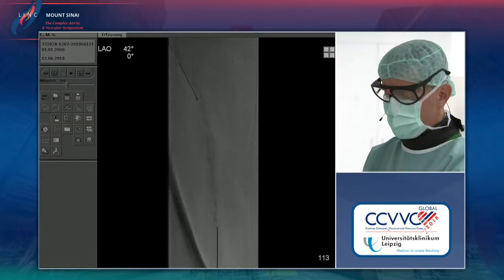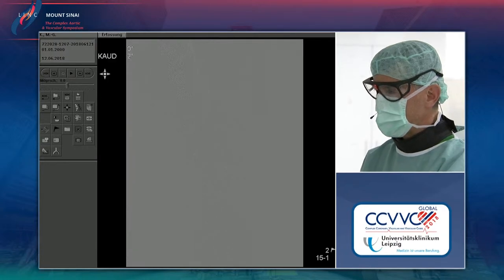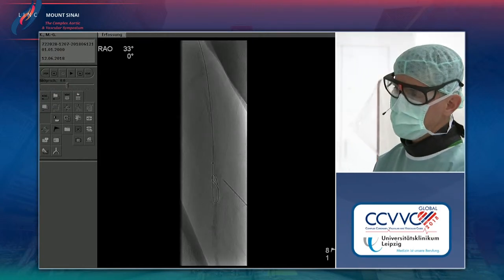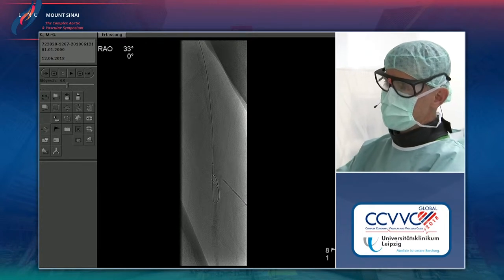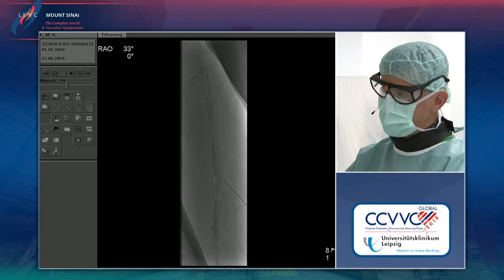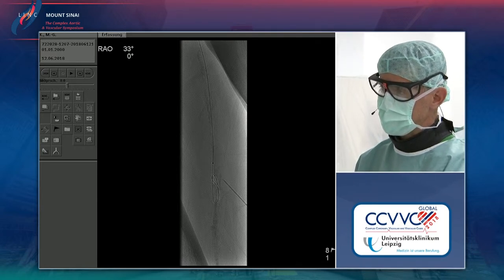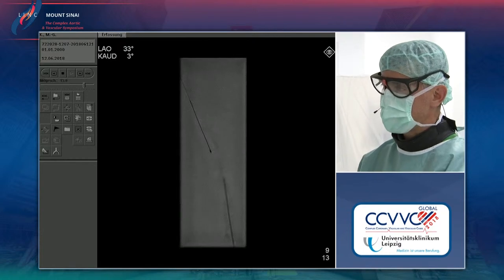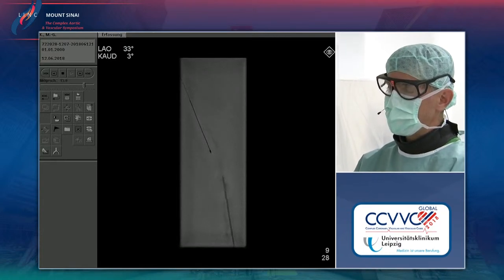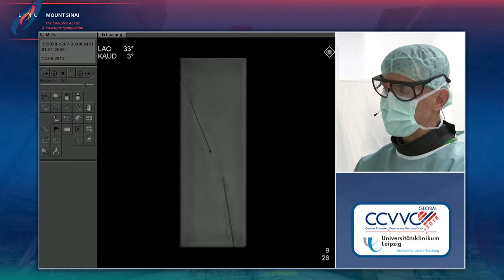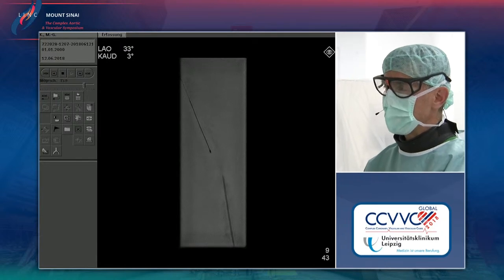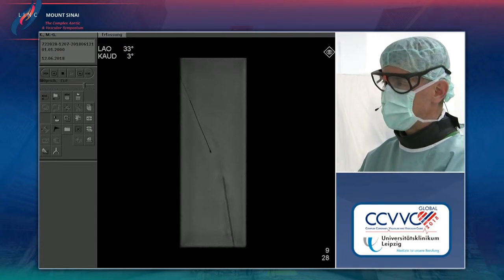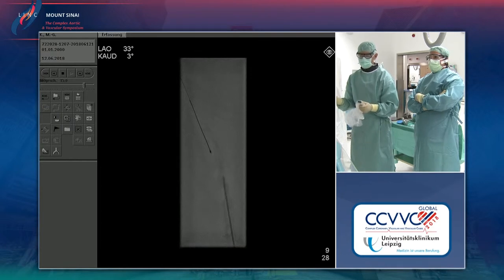We anticipate that once we balloon this region we may also have some more pain — ballooning pain in that calcium. So in these cases we take another needle down to that plaque and give local anesthesia there. This needle is not for gaining access but to really give one percent local anesthesia down to the plaque. You can see we try to reach down, move the needle a little bit, feel the calcium, see the calcium move, and that is then the place where we administer some local anesthesia. Usually we do the whole length of the SFA if it's calcified, which requires maybe two or three penetrations of the skin.